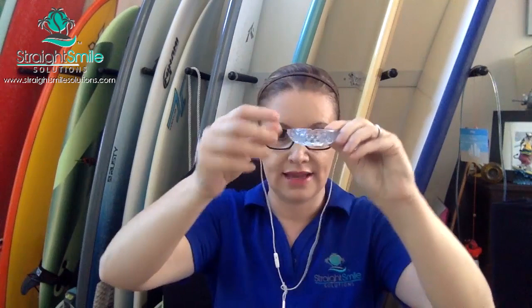They also offer expanders, Schwartz appliances, sagittals, any type of orthodontic appliance, and retainers. I'm super excited they sent me this box. I'm going to open it up and start pulling stuff out. They also sent me a ton of information about their finisher appliances — they call them pre-finishers. Pre-finisher appliances basically help to finish an orthodontic case, whether you're doing aligners or braces.